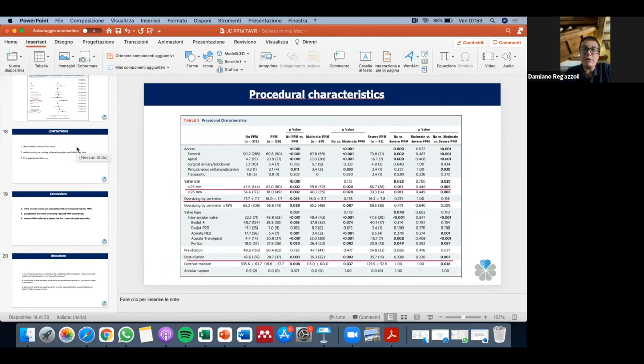It's really an easy procedure. But for every patient, you have to plan your procedure, because planning is really the thing that defines a good TAVR operator versus a bad or a mean TAVR operator. And for surgical valve failure, it's even more important. I totally agree with Francesco.